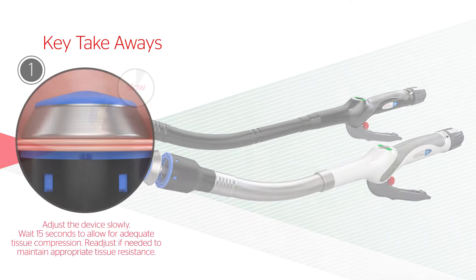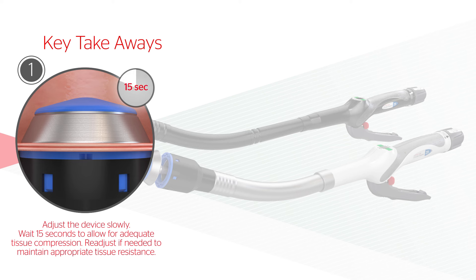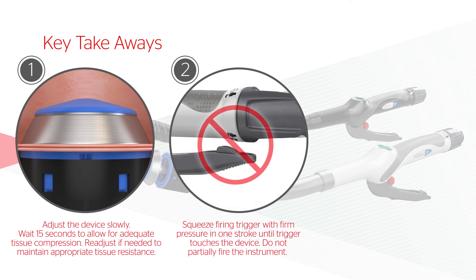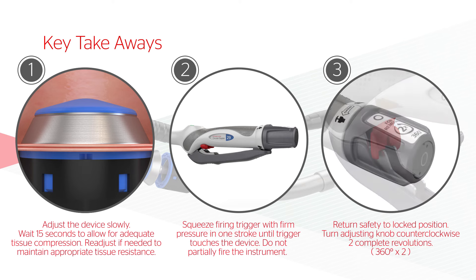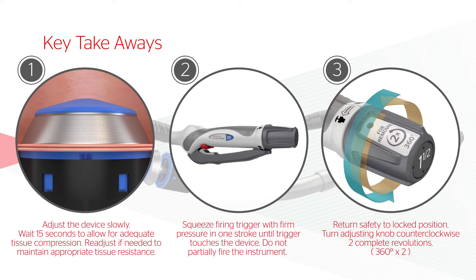Key takeaways: Adjust the device slowly until appropriate tissue resistance is felt for a secure anastomosis. Wait 15 seconds to allow for adequate tissue compression and readjust if needed to maintain appropriate tissue resistance. To fire the instrument, squeeze the firing trigger with firm, steady pressure in one continuous stroke until the firing trigger touches the device body. The firing stroke must be completed — do not partially fire the instrument. To safely release the device from the newly formed anastomosis, return the red safety to the locked position and turn the adjusting knob counterclockwise for two complete revolutions — 360 degrees times two.